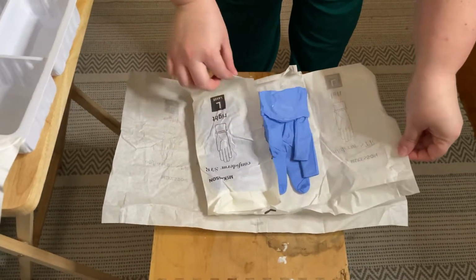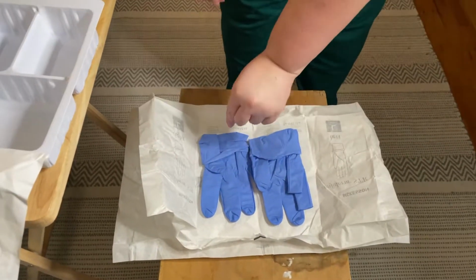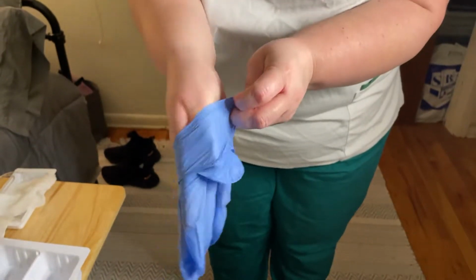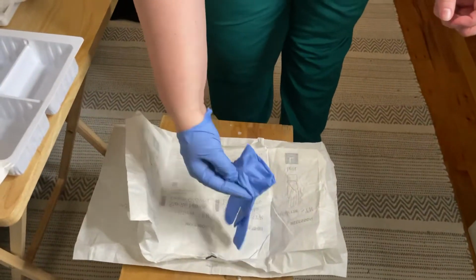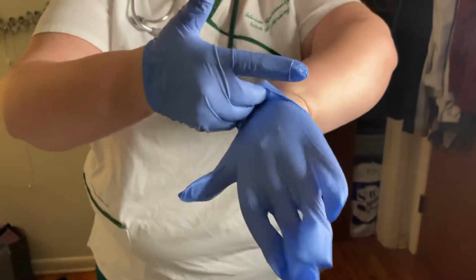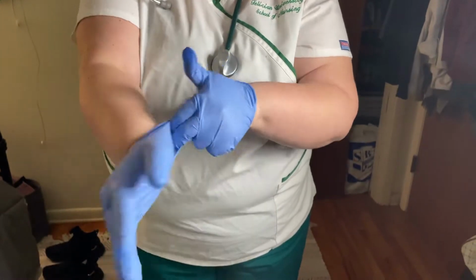This in the same fashion that we did the first pair. You're going to grab the cuff, slip your hand in, making sure that your hand does not touch anywhere on the sterile glove other than the cuff. Take your sterile fingers, go underneath the cuff, and put your second hand in. Pull up, and then use this to go under the cuff again and pull up, making sure nothing from your hands hits your skin.